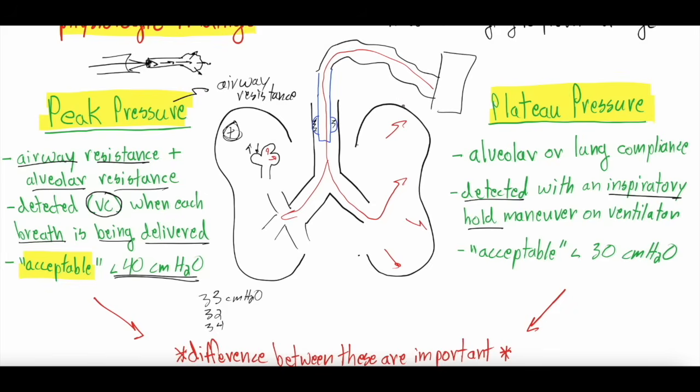But you can almost feel the pressure in your chest when you do that, right? Because your lungs are inflated, and your lungs are tissue. So as the air is pushing those lungs out, the lungs are also pushing back in. They're trying to deflate back down. And if you're not letting any of that air escape, the plateau pressure is the pressure that the vent is feeling as those lungs try to deflate when we won't let them. It's an inspiratory hold.